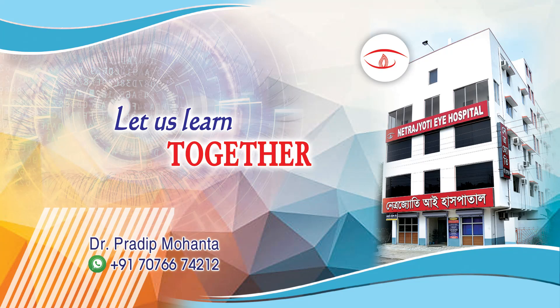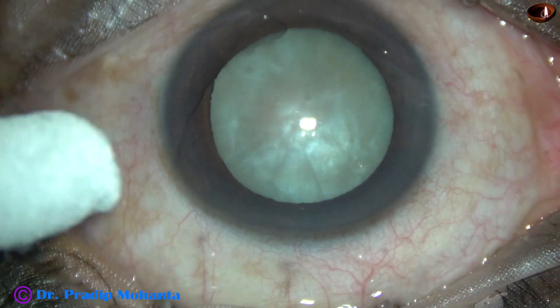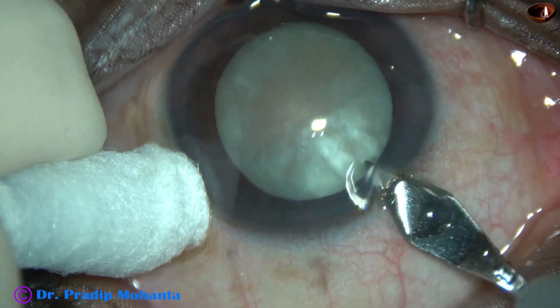Friends, welcome to my workplace at Ranakhart, West Bengal, India. This is a mature senile cataract. It appears like an intumescent cataract, but we will see in a short while that it is not.